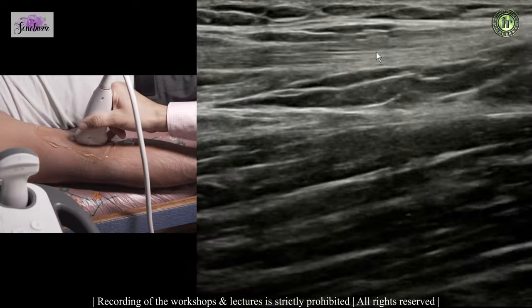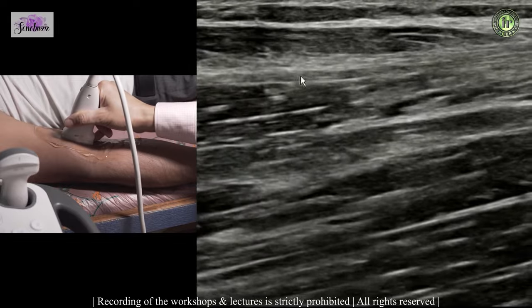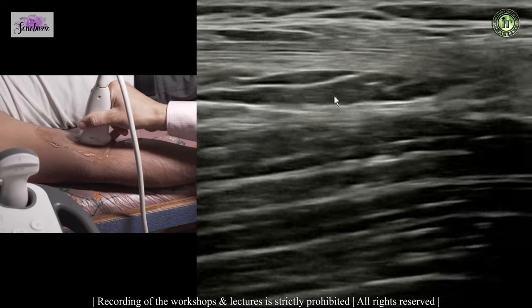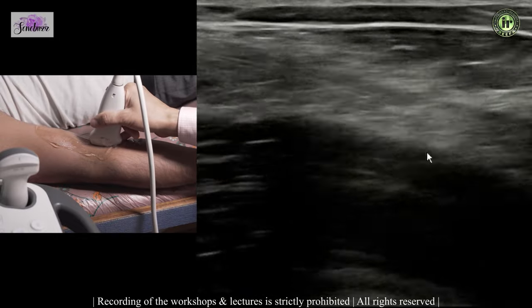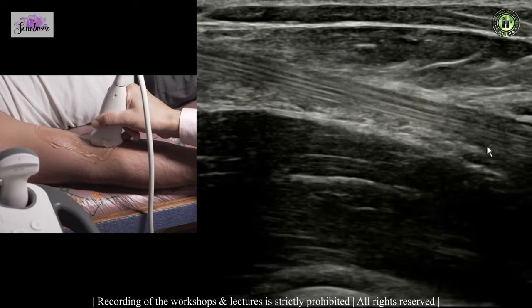Turn the probe 90 degrees and you see the biceps coming out from the muscle — that is the biceps muscle-tendon junction. This is the fat plane between the biceps and brachialis, and that is how you trace the biceps all the way to the radial tuberosity, which is located below the radial neck on the posteromedial aspect.